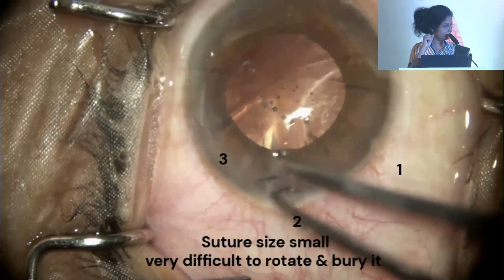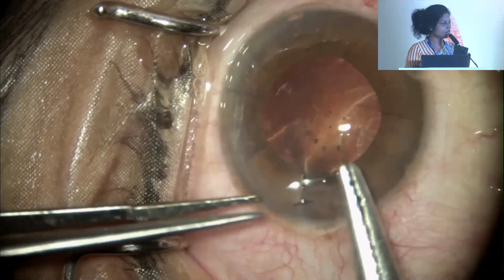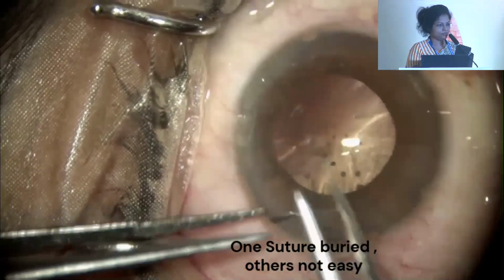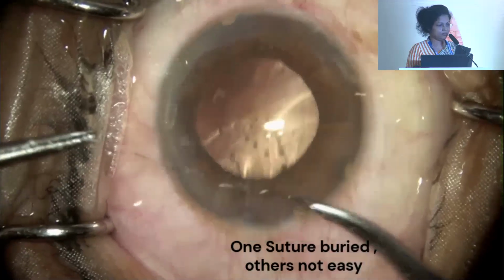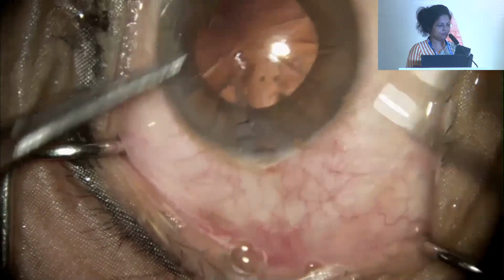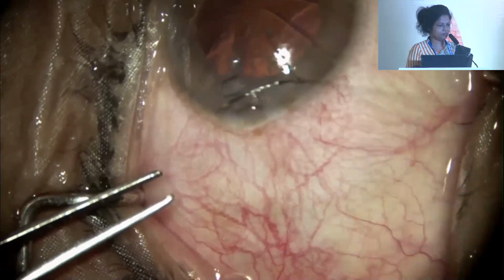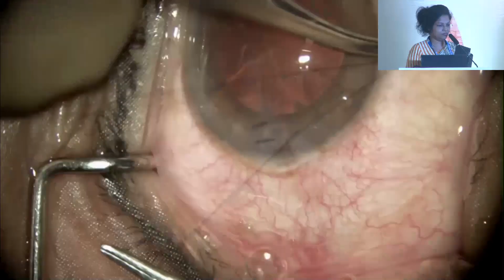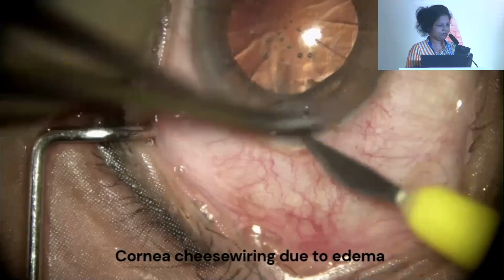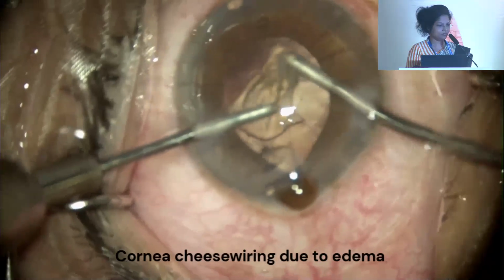Suture size? It's 10-0. One suture we were able to bury, but the next sutures were not that easy to bury. And because the RK wounds are so close to each other, while suturing there was corneal cheese-wiring near the wound because of the wound edema.